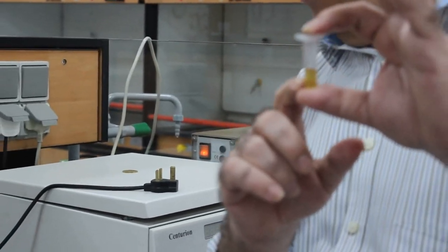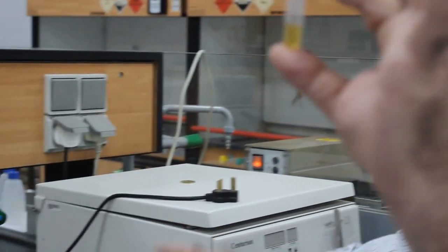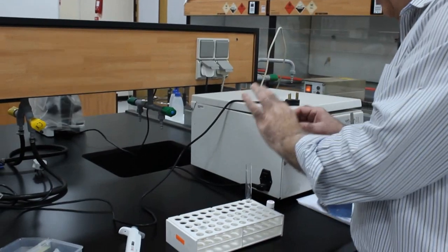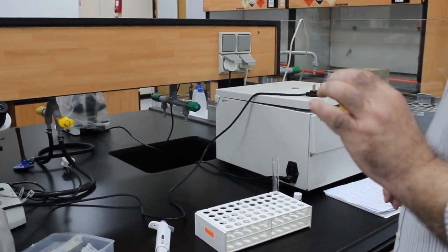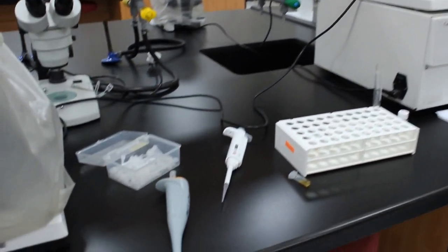And the plasma here has everything except calcium and tissue thromboplastin. So if I add the tissue thromboplastin reagent to the plasma, there is no reason not to clot if what I told you earlier is true. Otherwise, I wouldn't be doing you a favor.